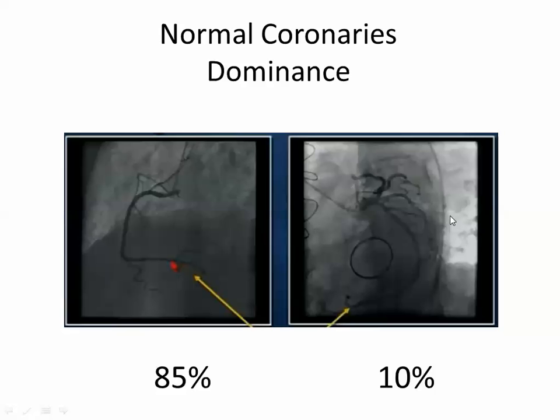This is the wire of the CABG in the sternum. Okay, and this is okay. It's not CABG because this is what? Valve. Okay. Valve replacement. So what's this view? LAO, as you said.